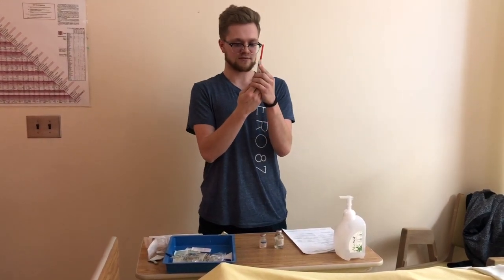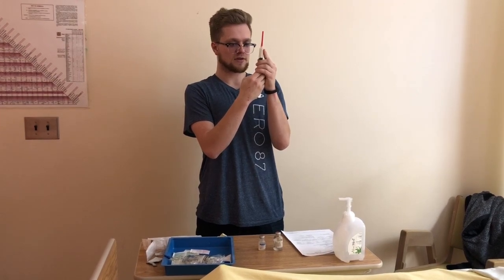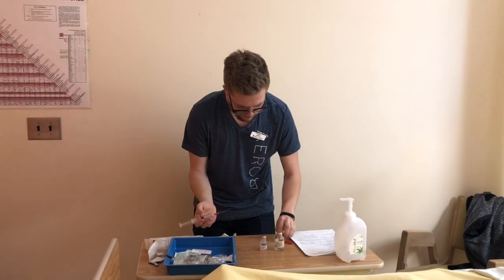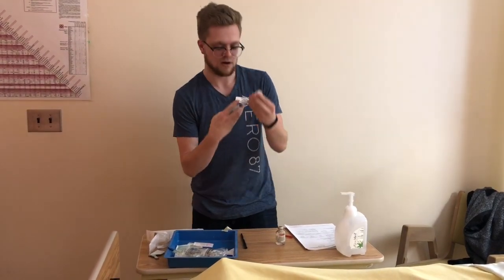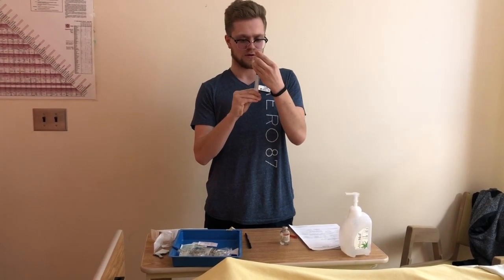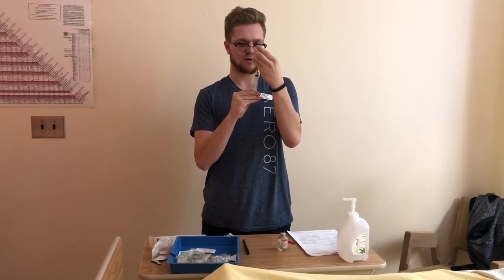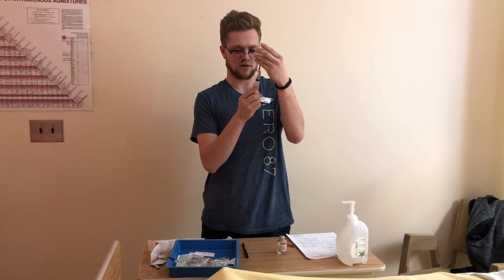I'm going to take up 6.8 mLs of air to inject. Make sure you get that in there. Perfect. So, injecting that into here. All right, and then we'll inject the air. And then we'll be taking out our sterile water. There will most likely be bubbles, so we're going to need to take those out as well.